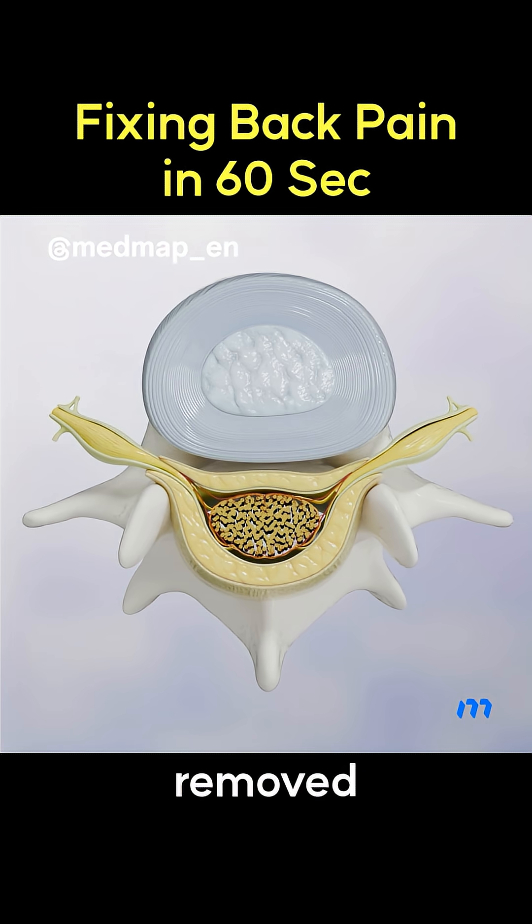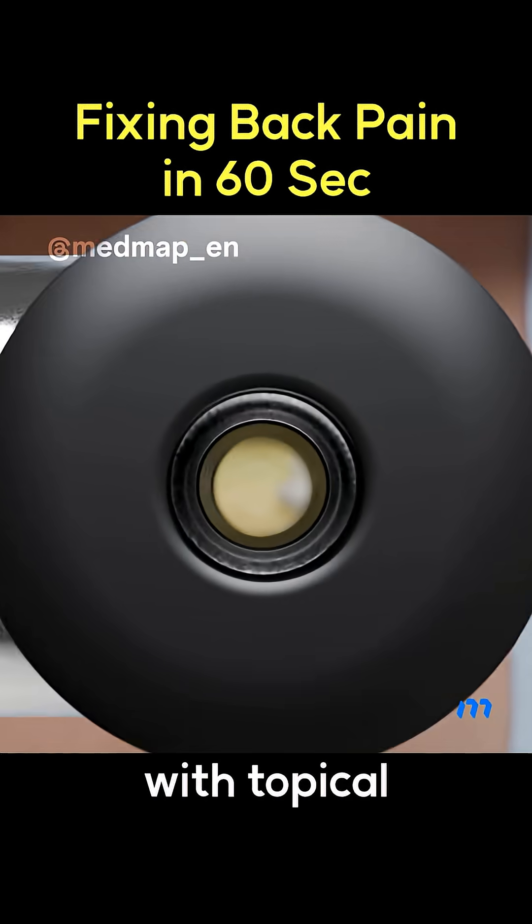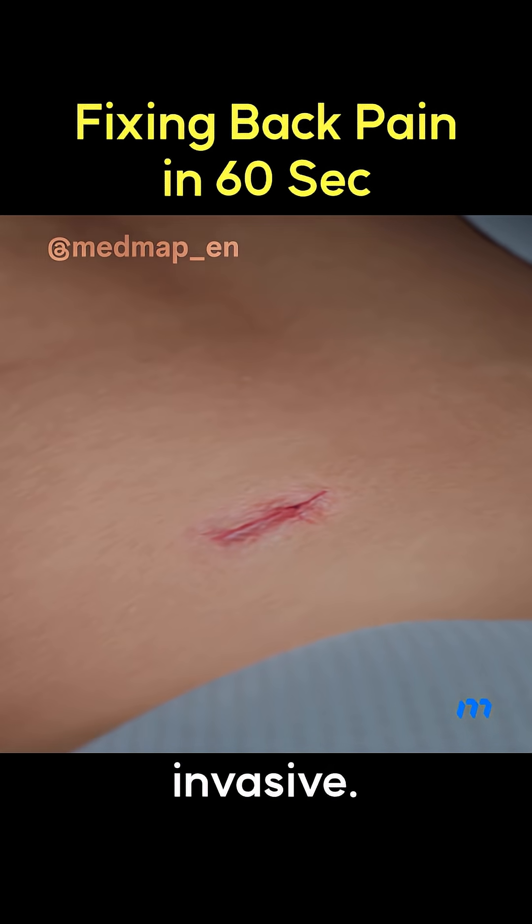The herniated disc is removed and decompression is complete. Incisions are sealed with topical skin adhesive. This is IELD — clean and minimally invasive.